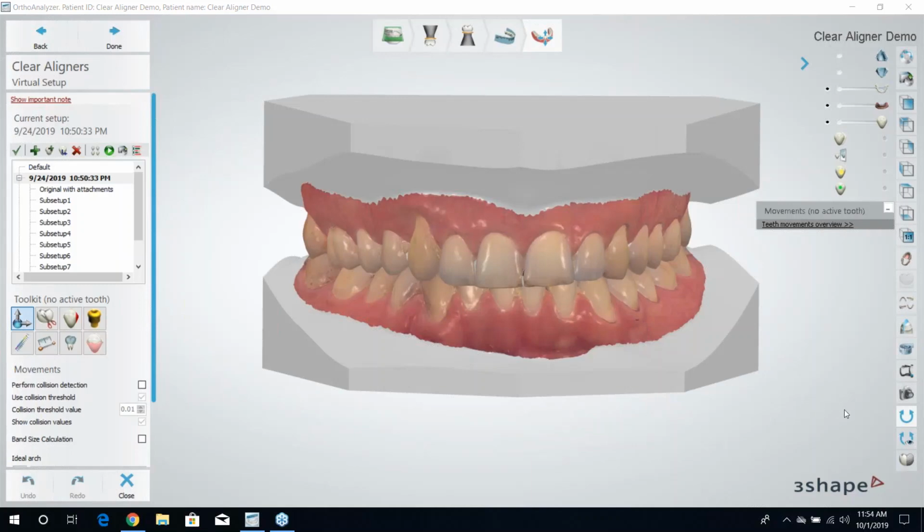What is the recommended charge for a clear aligner? It's a really hard question for a couple of reasons. The biggest being your market. Markets are different. Something that costs a certain amount of money in LA is going to be very different from the cost in Kansas.